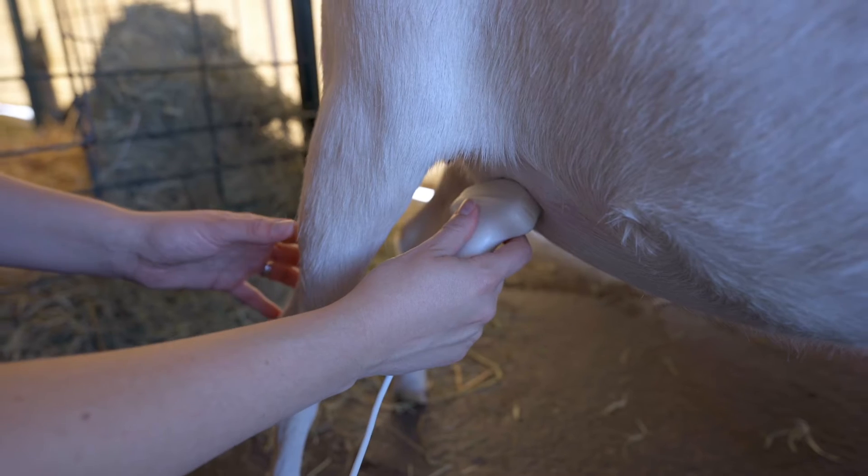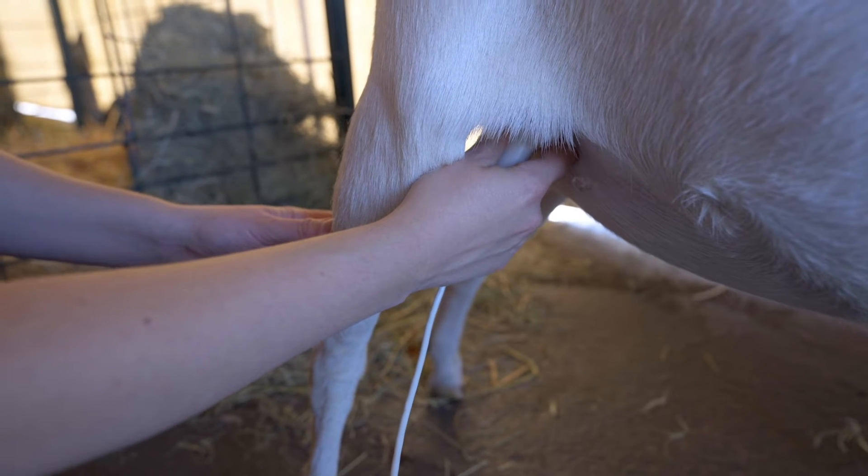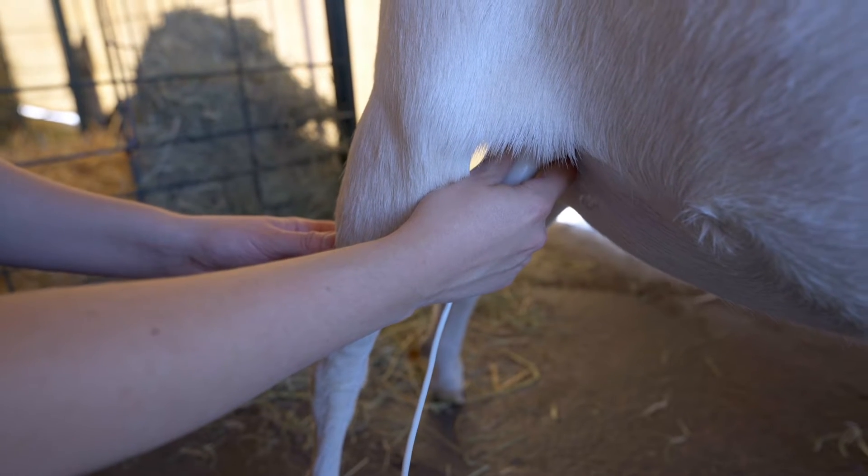The best side to start with is on the right hand side of the doe, putting the probe up under her back leg. I'm putting the probe up underneath the back leg because she is a young doe and she hasn't had a pregnancy before.